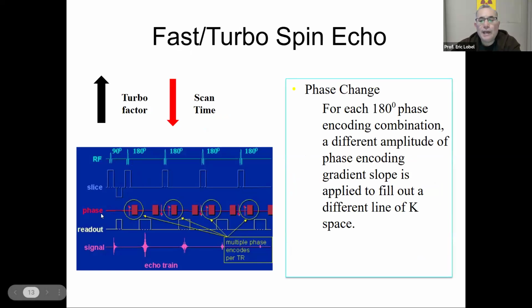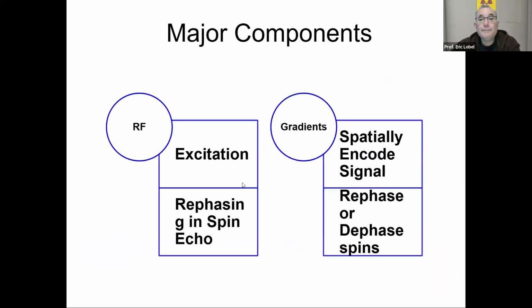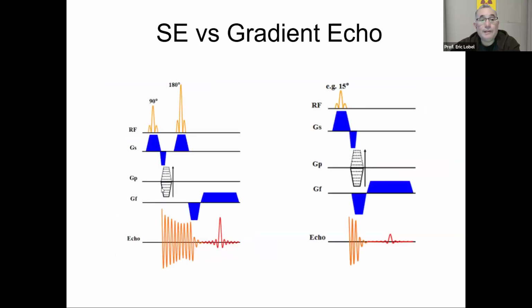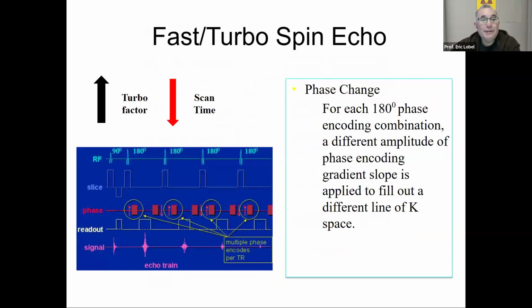Here's our phase encoding. And instead of looking like these, it just looks like a block with an arrow up or an arrow down. But same thing is happening though. We're still in the slice. This is 1, 2, 3, 4. Also has an ETL of 4.